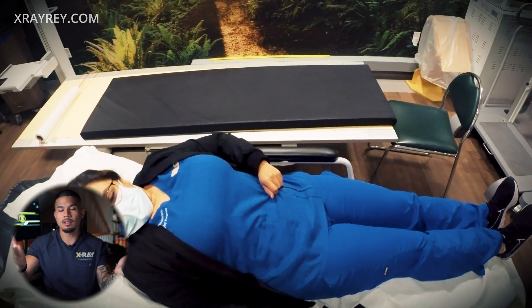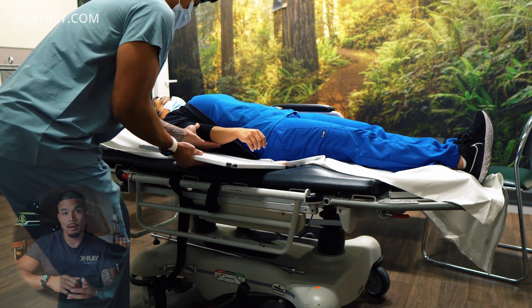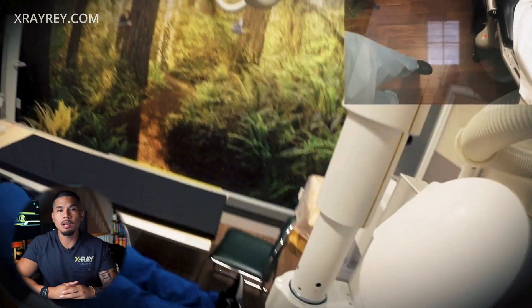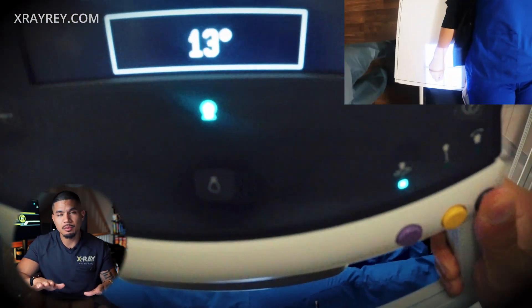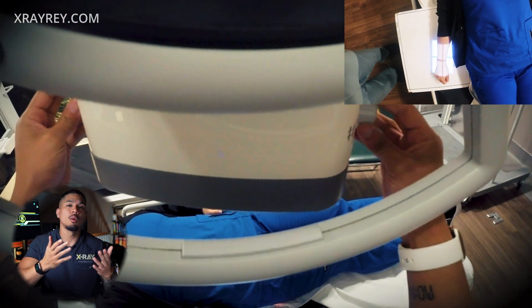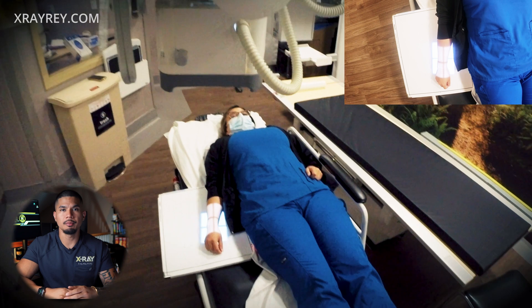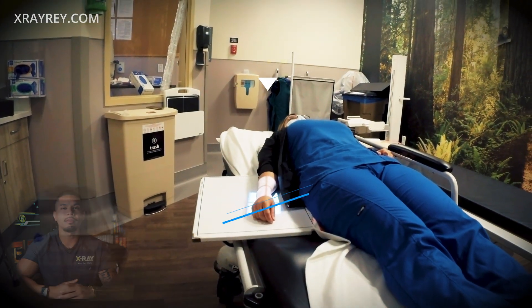Move them over so I have enough surface area for my image receptor to lie on, and then place the IR under the arm. Now if you're used to shooting your AP or PA first, this may throw you off. In reality, you don't have to shoot them first — you can simply start with what your patient gives you or whatever position you want. Just make sure the IR is under the correct position: shoot the oblique under the oblique, the PA under the PA. In this case, my patient's arm is naturally lying in an oblique, so I'll take that first.